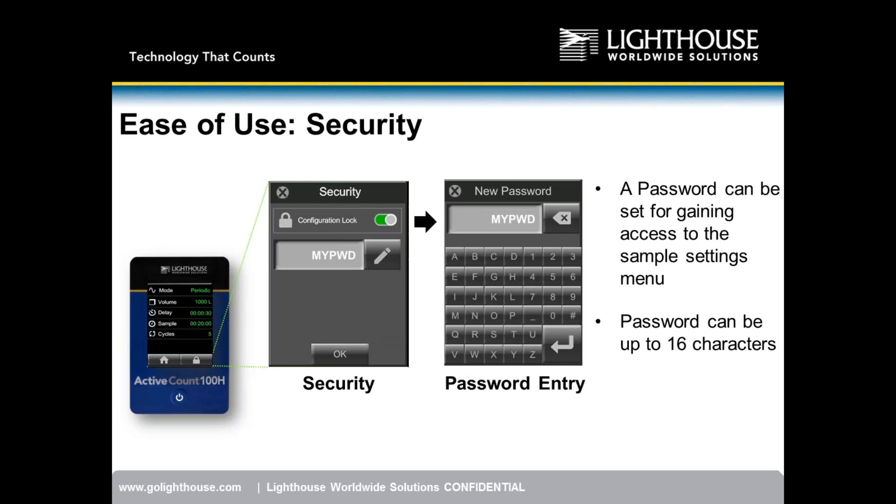There is an onboard configuration password that locks out the configuration screen. Once sampling parameters are entered, you can add a password to prevent other users from changing them. The password can be up to 16 characters long — a combination of numbers, a dash, a number sign, or letters. Simply swipe right to enable the password.